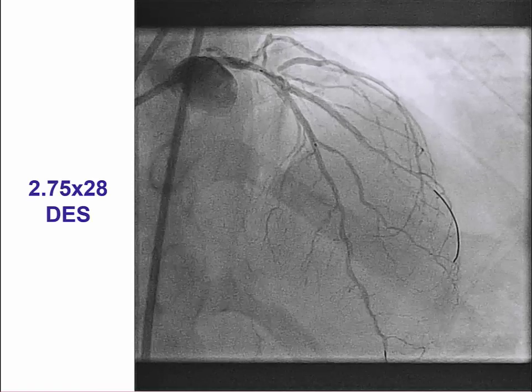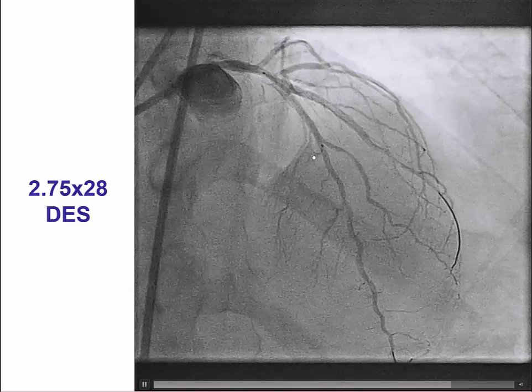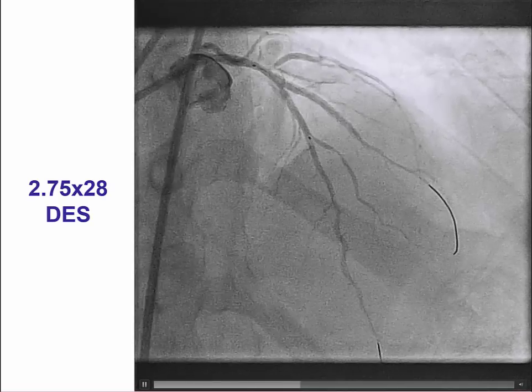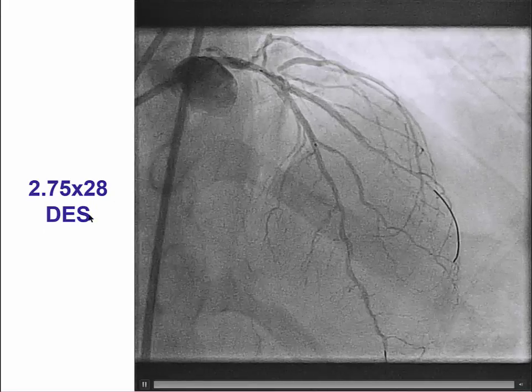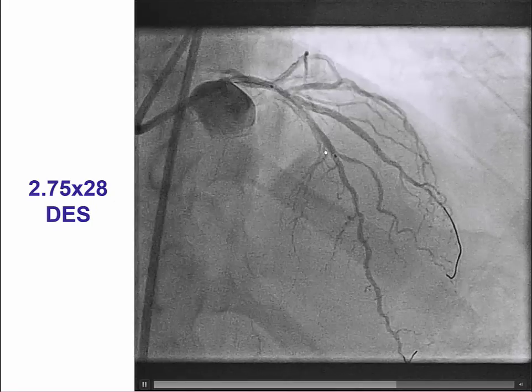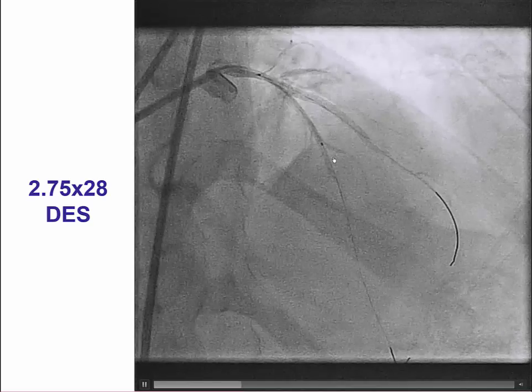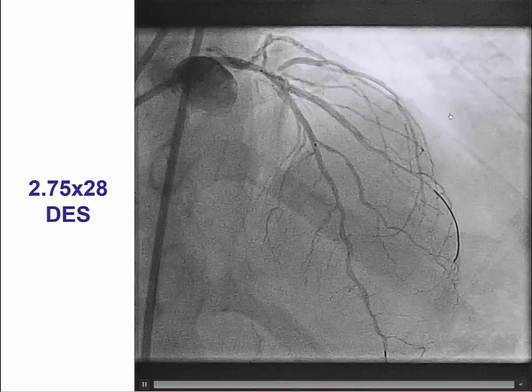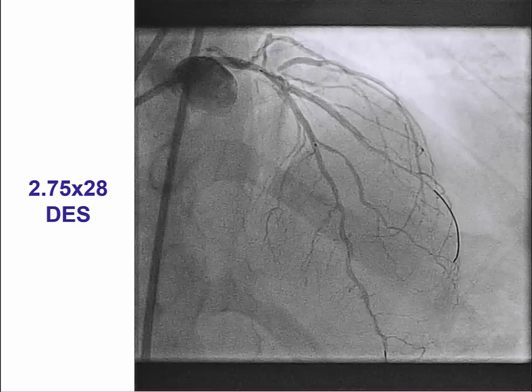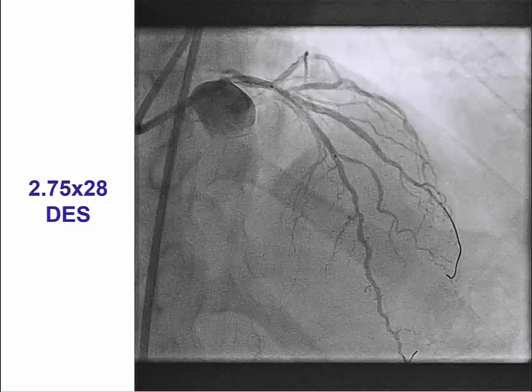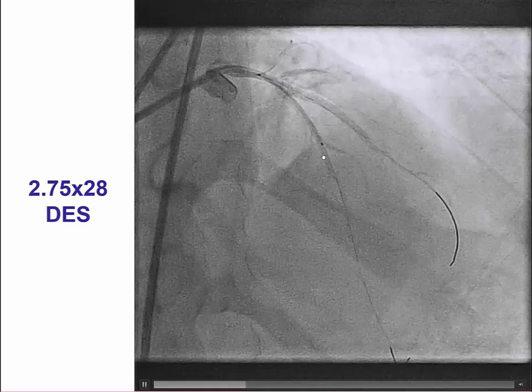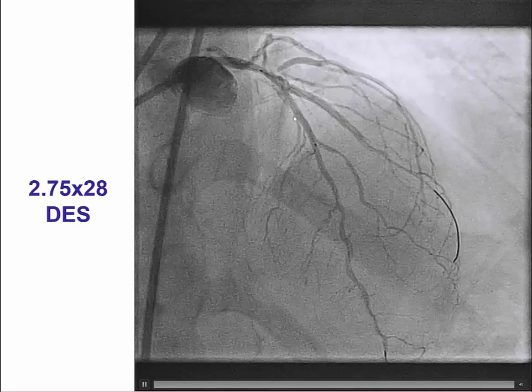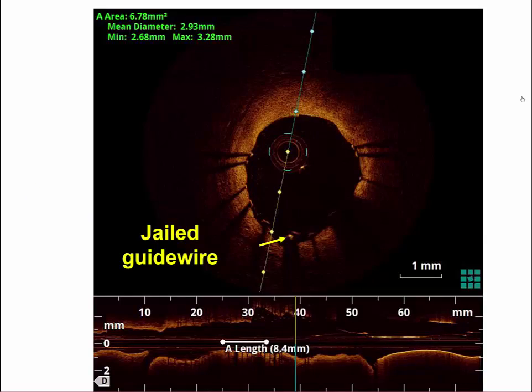The next step is to position the main vessel stent, which is deployed into the main vessel. This is a 2.75 by 28 mm drug-eluting stent, sized based on the size of the distal vessel as for any PCI. There is a larger proximal vessel, which can then be optimized with the POT technique. We always size to the distal vessel to minimize the risk of distal dissection. OCT done afterwards demonstrates the jailed side branch guide wire under the nicely expanded and well-apposed stent.